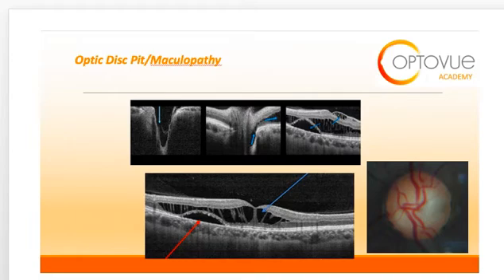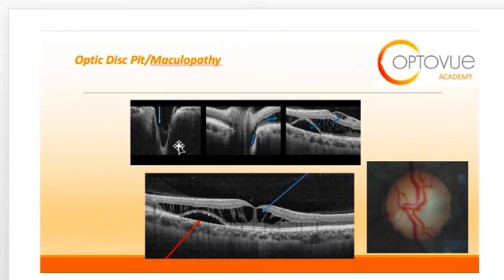On the top three OCTs, the pathophysiology behind optic disc pit maculopathy is illustrated. The pathophysiology is thought to involve fluid originating from the vitreous or subarachnoid space entering through the optic nerve head through the pit, resulting in a separation of the outer retinal layers. Fluid can then move from the outer retinal space to the inner retinal layers, which results in the maculopathy described before.